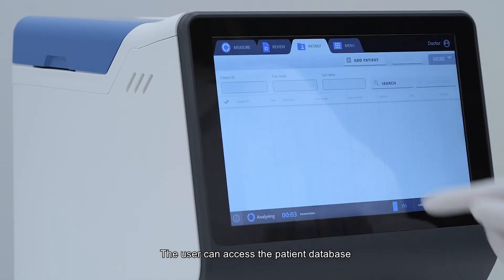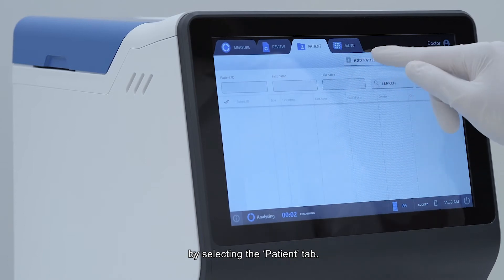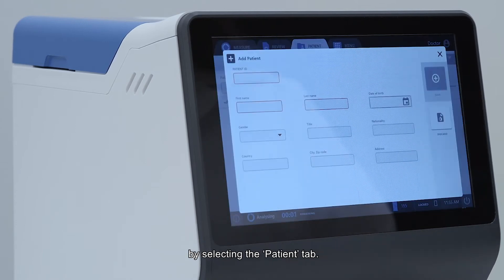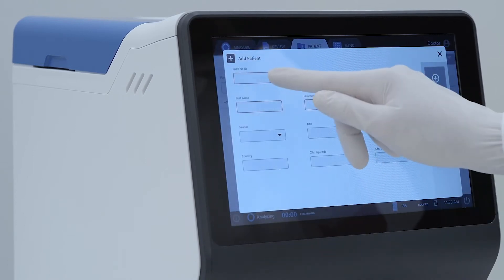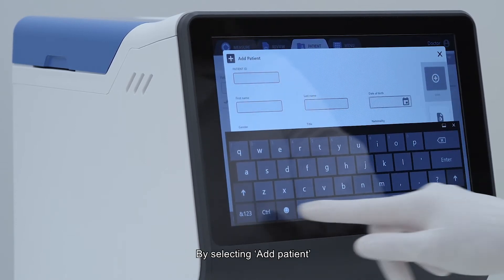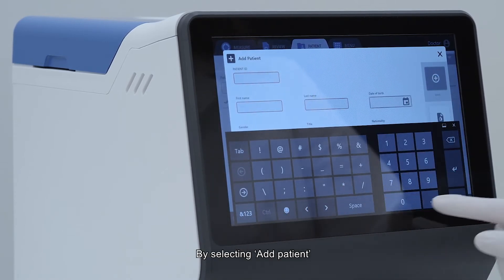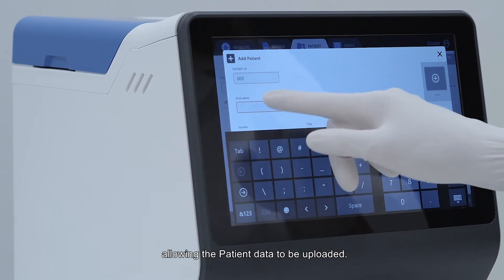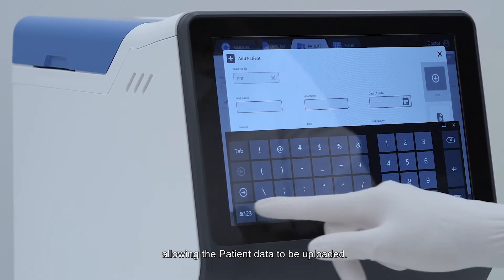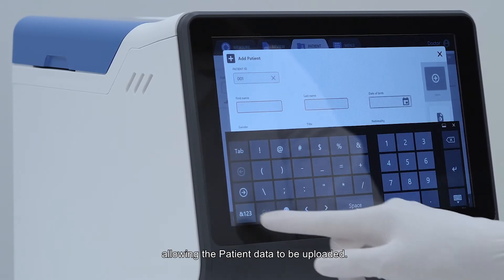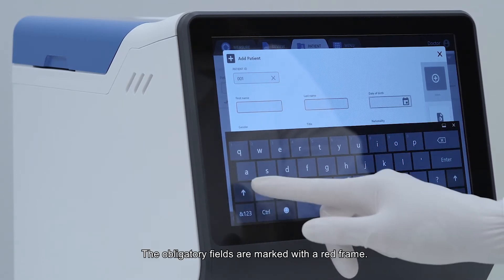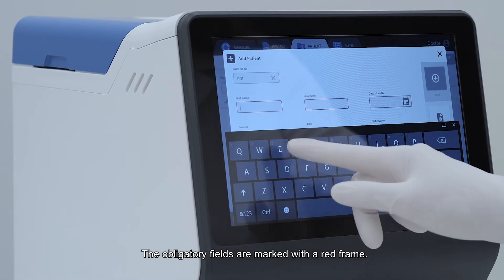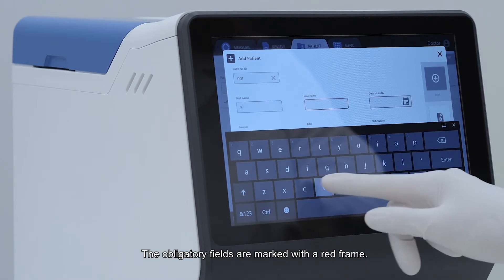The user can access the patient database by selecting the patient tab. By selecting add patient, a new window will appear allowing the patient data to be uploaded. The obligatory fields are marked with a red frame.